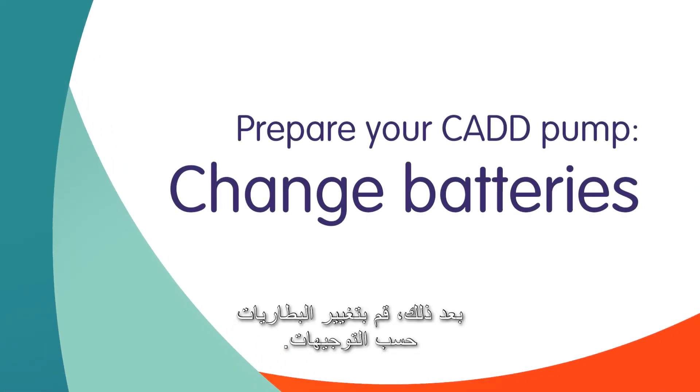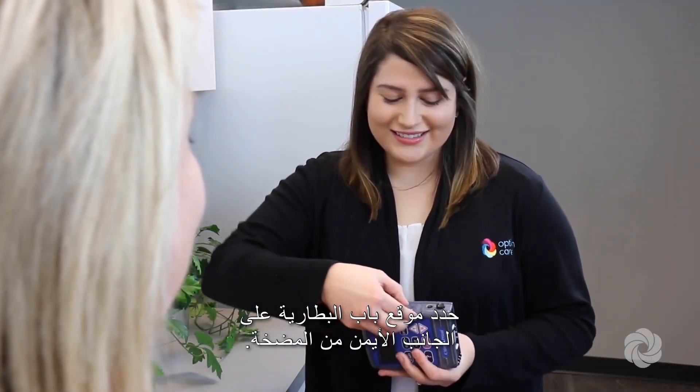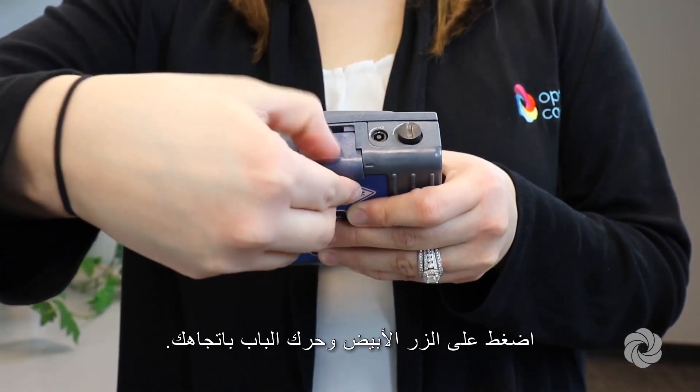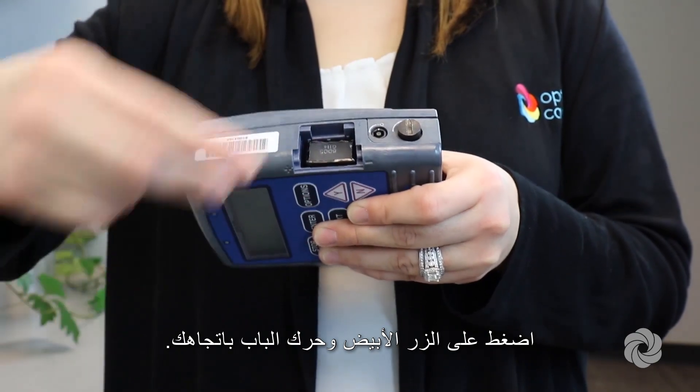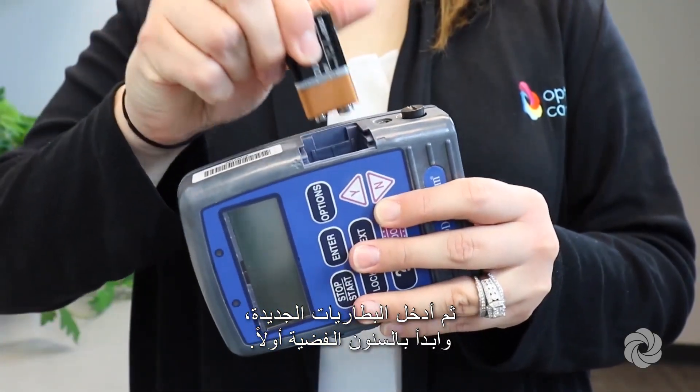Next, change the batteries as directed. Locate the battery door on the right side of the pump. Press the white button and slide the door towards you. Remove the used batteries and discard as instructed. Then insert the new batteries, silver prongs first.